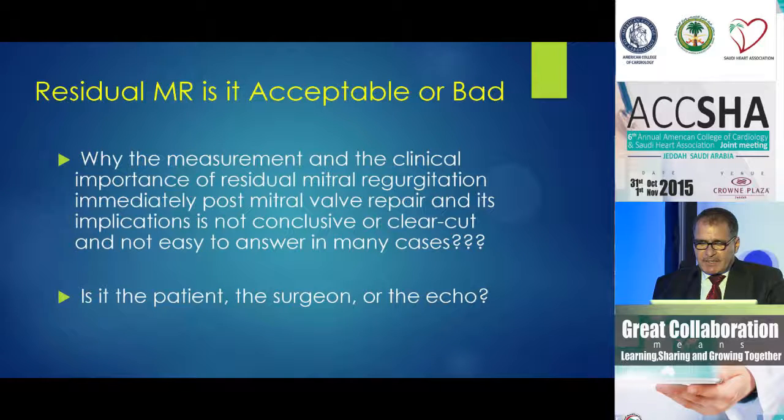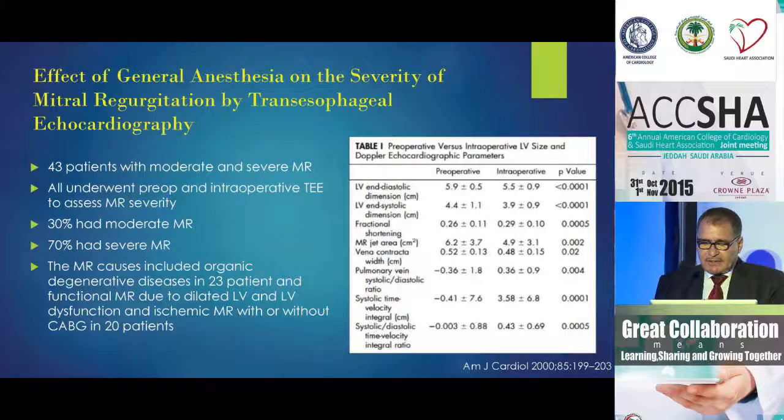Yeah. Residual MR, is it acceptable or bad? I mean, definitely residual MR is bad. But what's the meaning of bad here? It means that there are many problems, the risk of reoperation, and the survival rate is going to be quite different when you have residual MR. I will show you why residual MR sometimes is misleading when you measure it in the operating room.